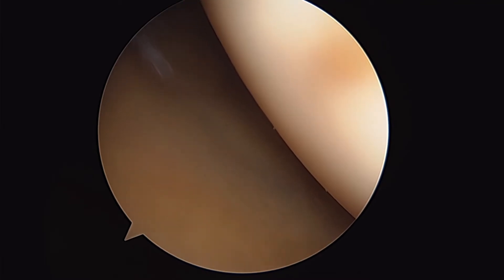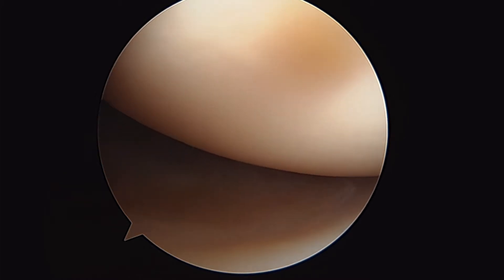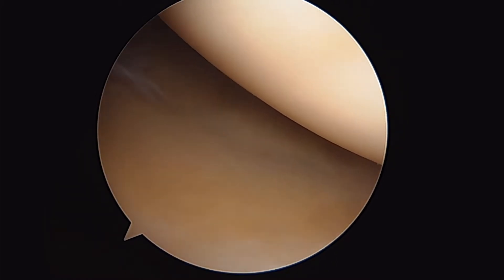Middle-aged, about 35-year-old male. We're in his right shoulder. This is the glenohumeral joint, so looking straight on — that's the humeral head, and this is the glenoid.